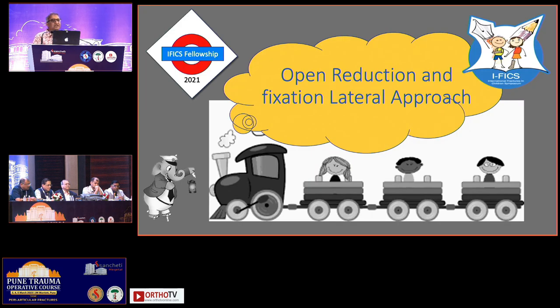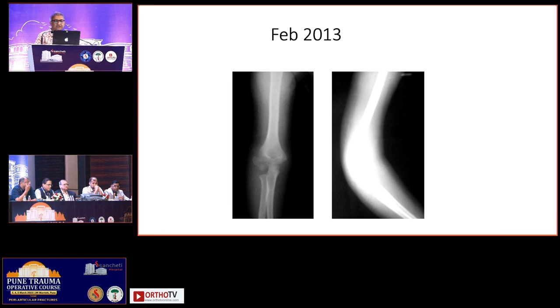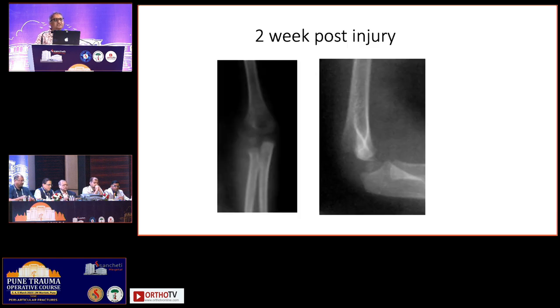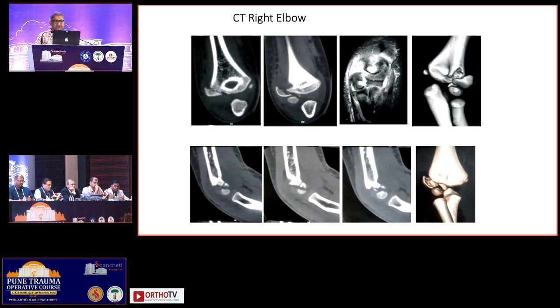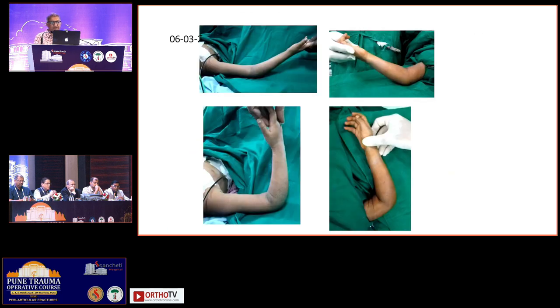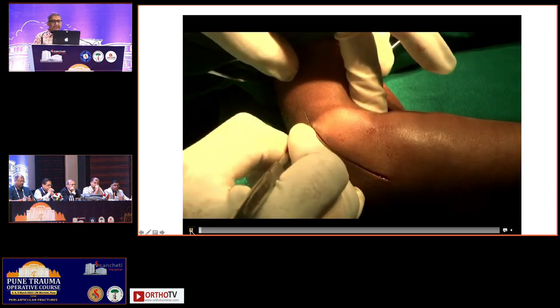The second procedure I want to show you is open reduction and fixation through a lateral approach. So this was a 7-year-old child who had a lateral condyle fracture, which went into non-union, displaced, and for this patient the only option was to do open reduction. So I'm going to show you the range of movement before surgery and how to do the open reduction. Harshad has shown you a similar case, but I use a lateral approach.